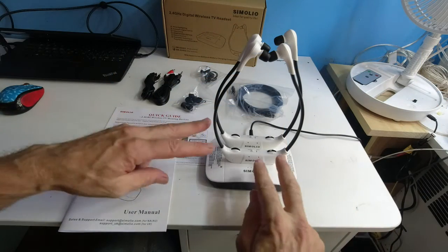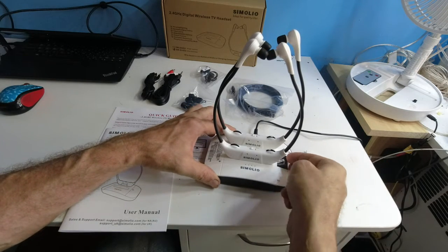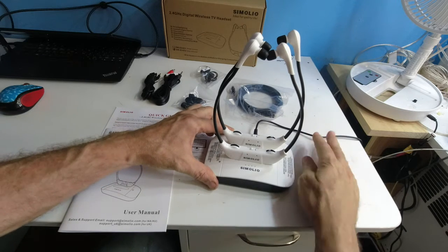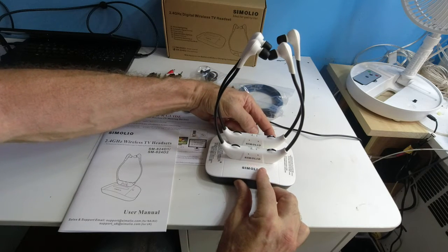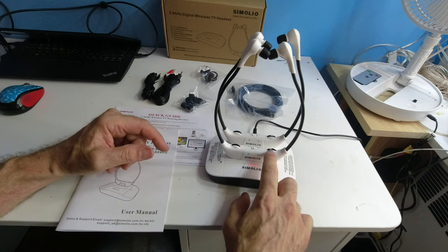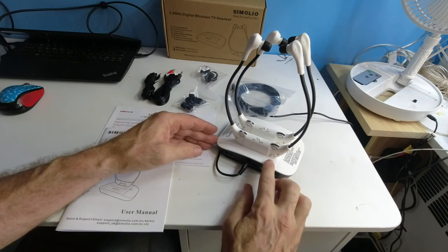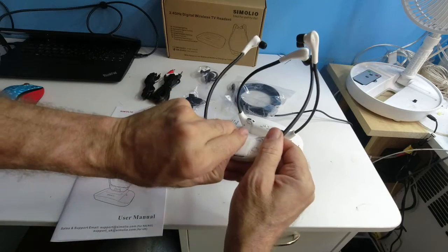Everything out of the box: you're going to get two headsets, a spare battery located on the side of the door in case one goes bad. You get a power supply that is pretty long. There's an indicator light when you turn the unit on in the back, the on button, the volume balance button, the volume up and down button. On the back of the unit itself is a mic off button and a location for the battery to install.